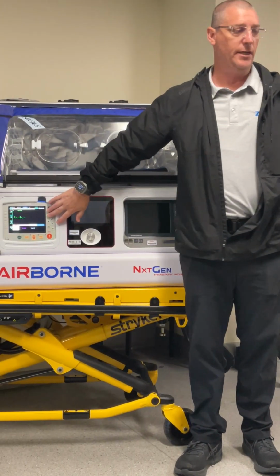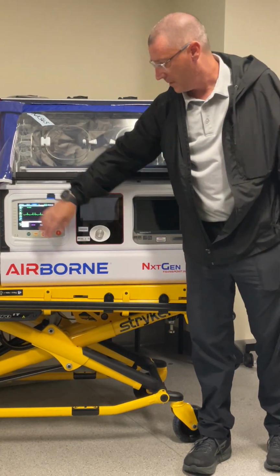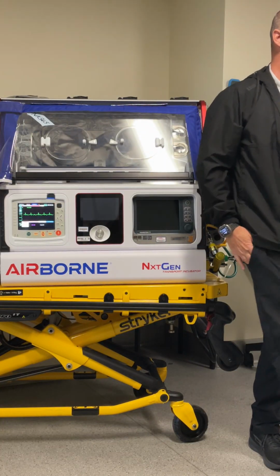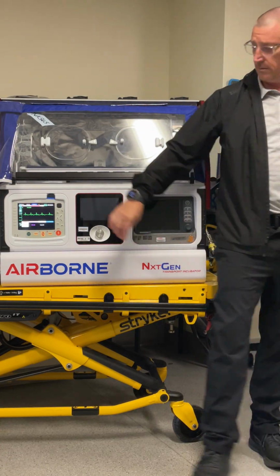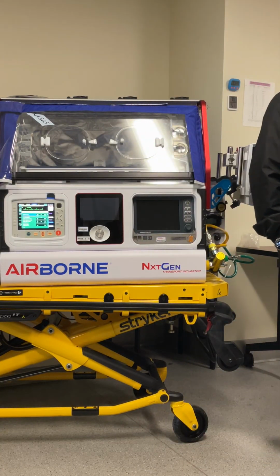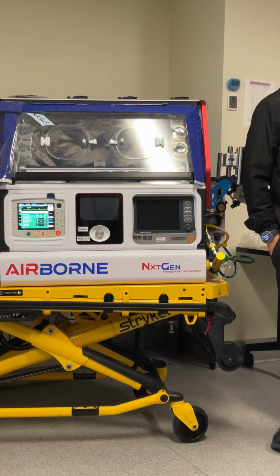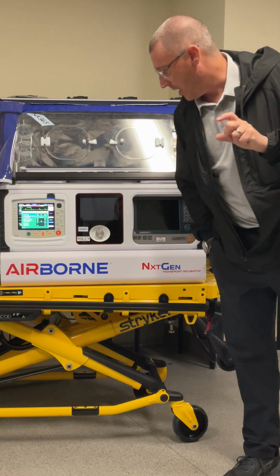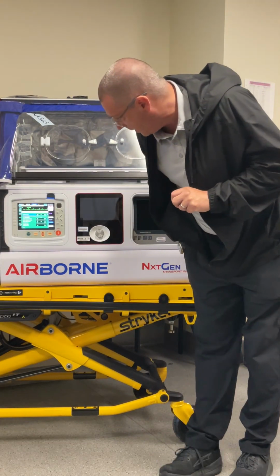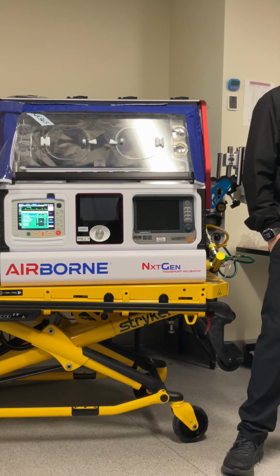If you got something up on the screen, hit your home key. The boomerang arrow will get you out of there. The bell. Let's go into the bell. Go to limits. Here's all the alarms for the device. Anything that has a bell next to it is an alarm that we currently have turned on. So heart rate 100 to 200 is what we got set in there. MAP of 25 to 50 is what's set in there.